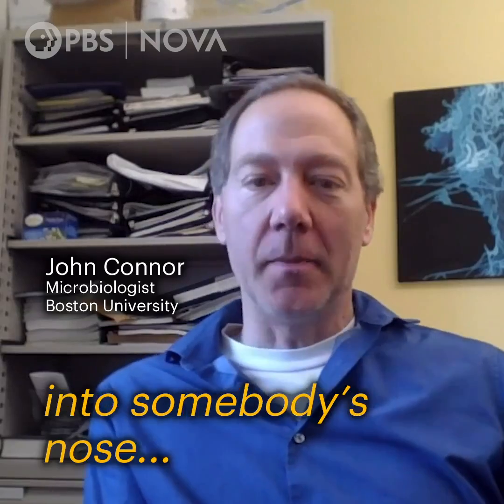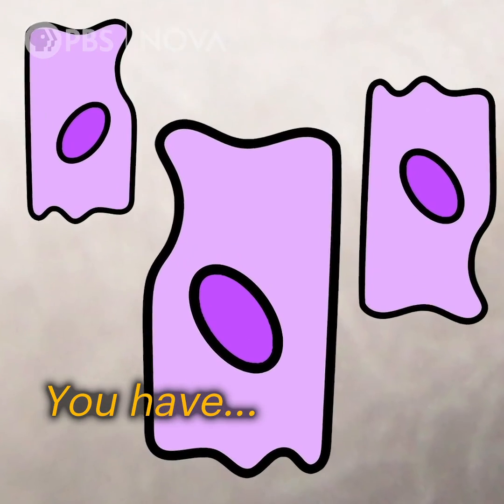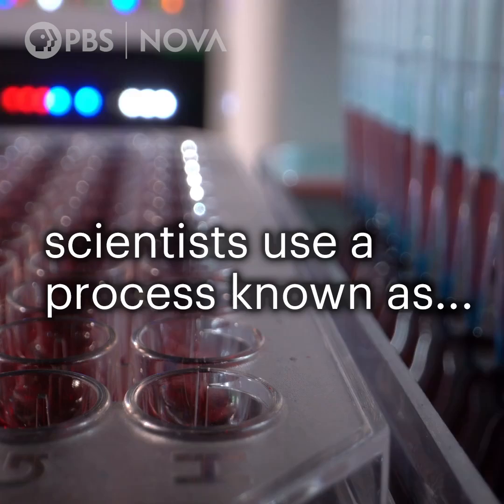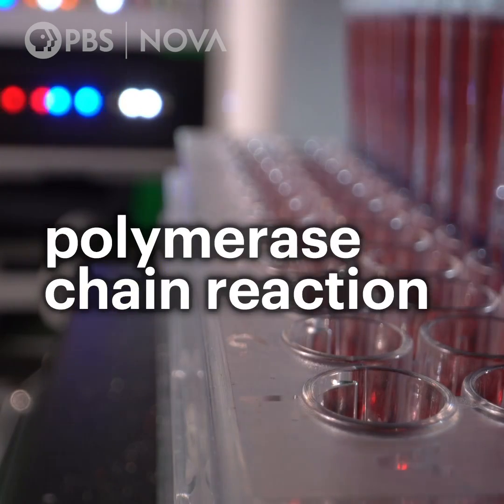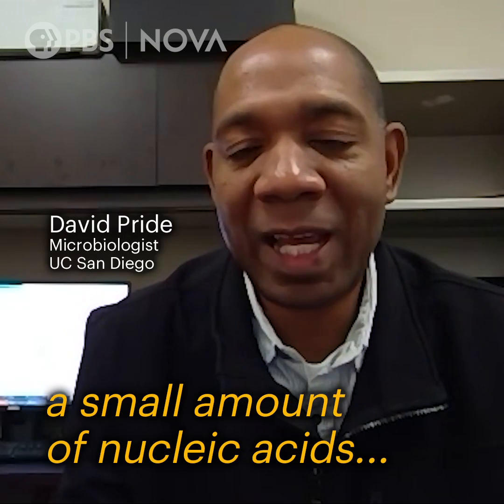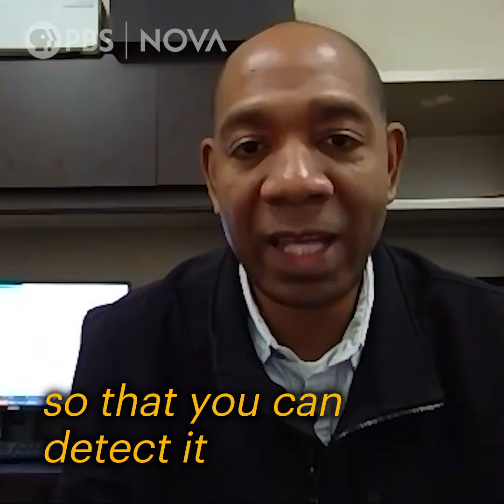You stick a swab into somebody's nose and you pull it out, and what's on it? You have some of your cells. You have potentially virus. To find out if the virus is on that swab, scientists use a process known as polymerase chain reaction, PCR. Basically just a way of taking a small amount of nucleic acids, or RNA specifically for this virus, and turning it into a lot of nucleic acids so that you can detect it.